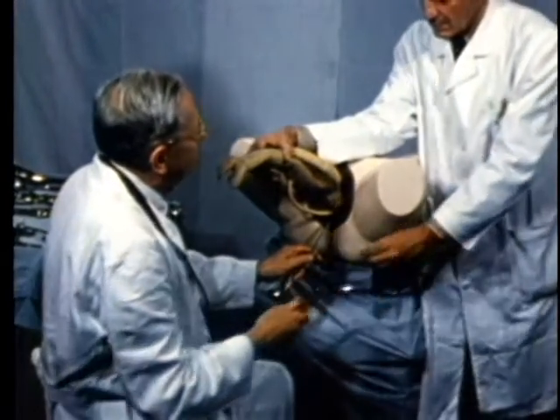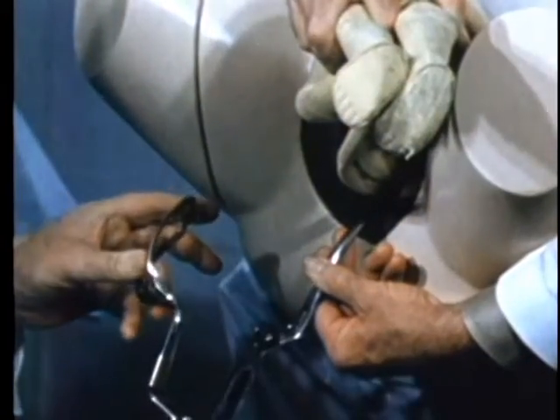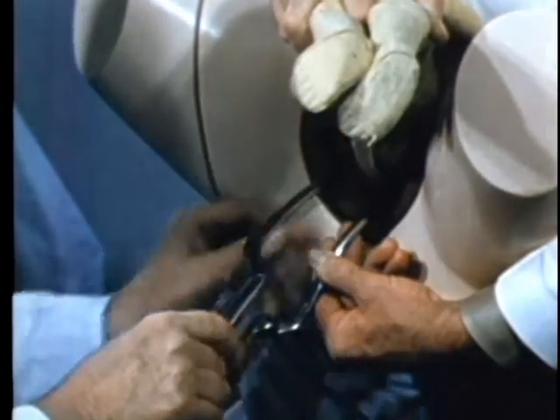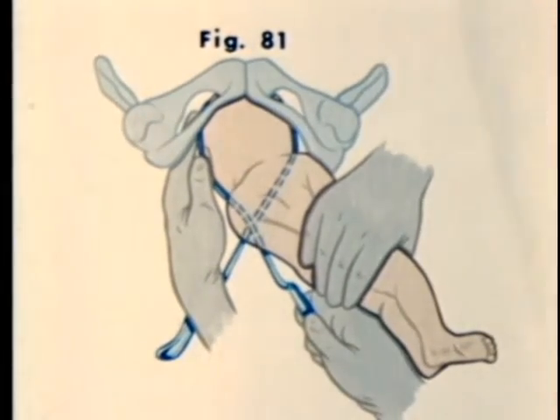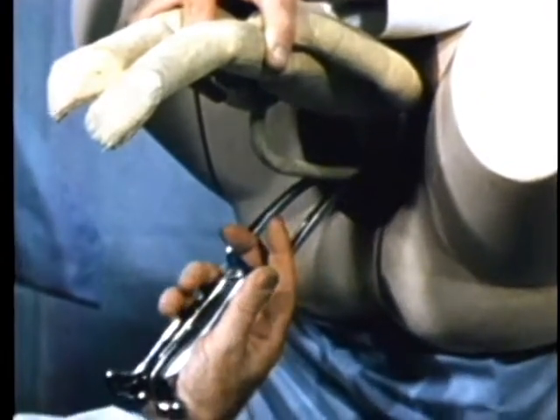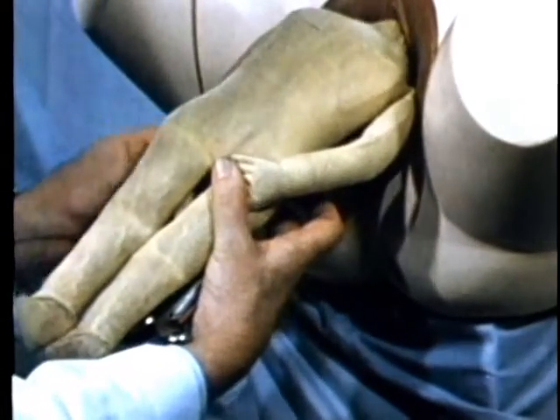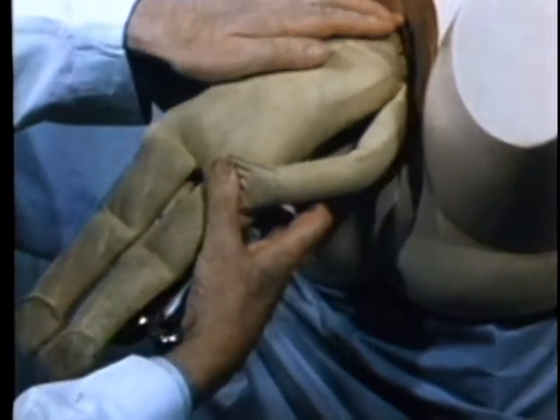Once in place, the assistant carries the body to the opposite side, exposing the approach to the right side of the patient for the introduction of the right blade. The handle is held near the left thigh and carried inward and brought around to the midline and dropped into locking position. Then the upturned palm of the right hand grasps the handles with the middle finger in the space between the shanks. The body is lowered and the thigh is clamped to the handles by the thumb, and the hands are encircled by the thumb and the fingers to keep them out of the field of operation.